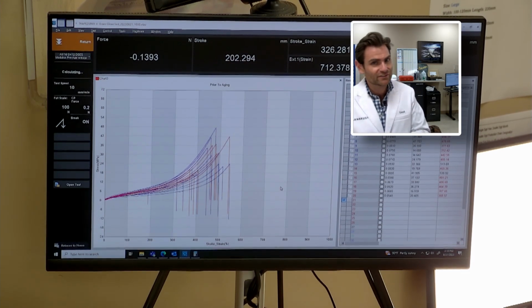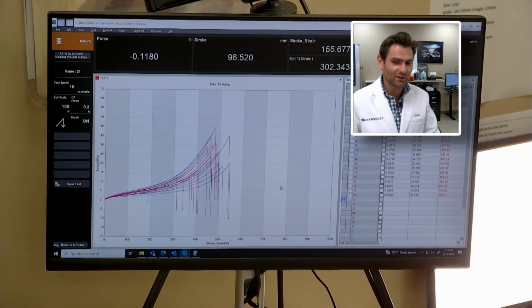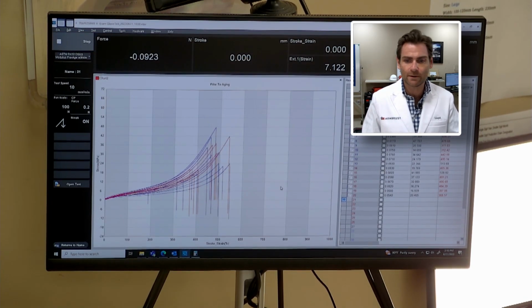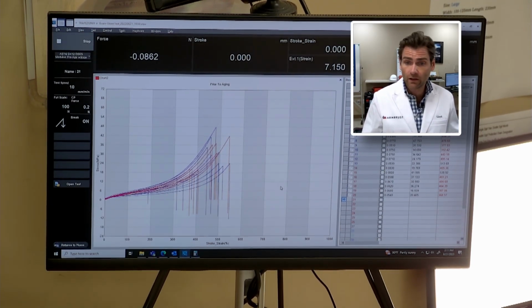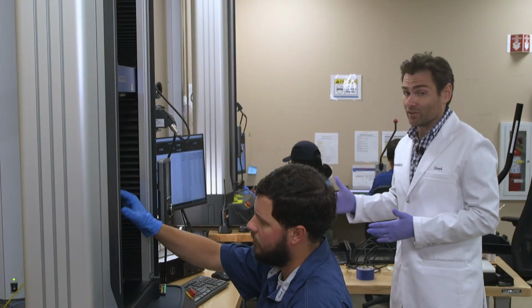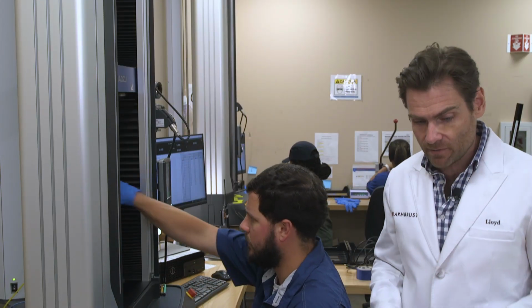This Comfy Package is not working too well. Okay, so it had an elongation of 368.57%, but tensile strength of 20.4, not horrible on that. Again, it's failing American standards there, which is not a surprise because China is really, really great at manufacturing a lot of things, but they did not manufacture gloves until very recently. So I think the glove manufacturing scene is a little bit new there, and they don't have all of their things dialed in. That's just my opinion.